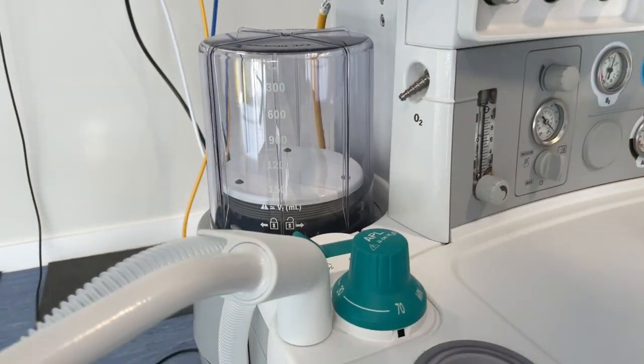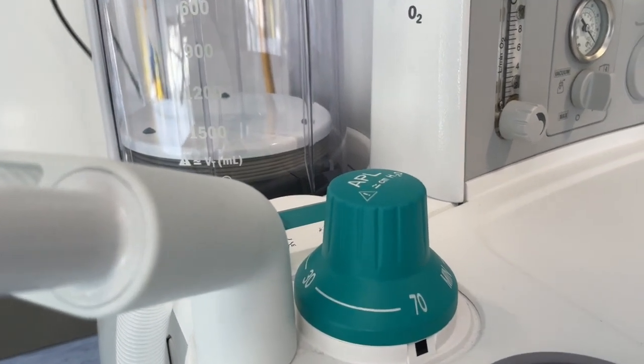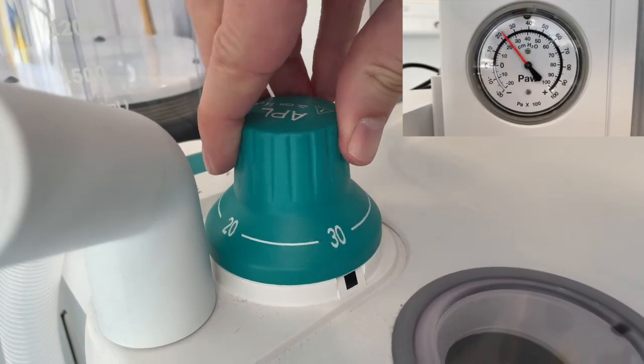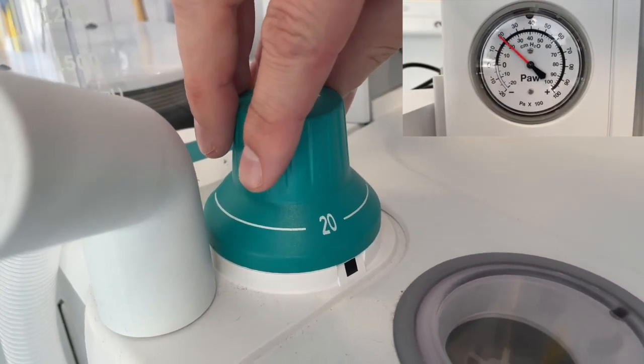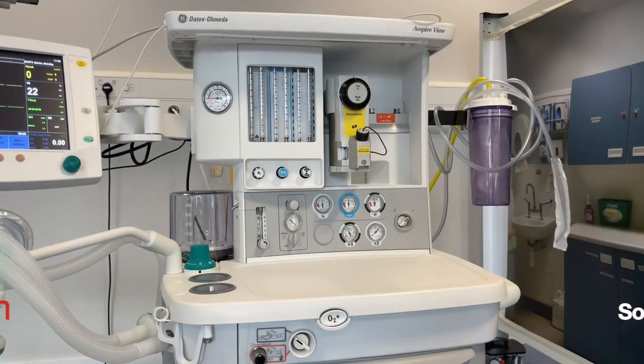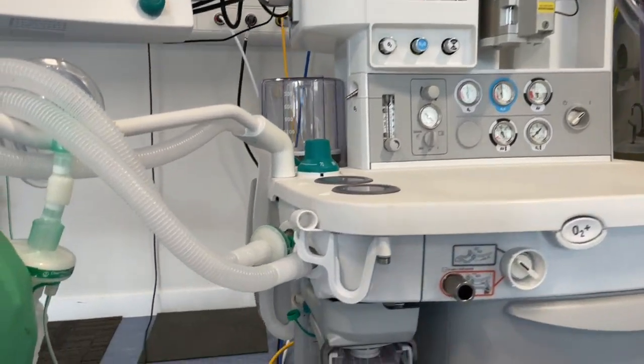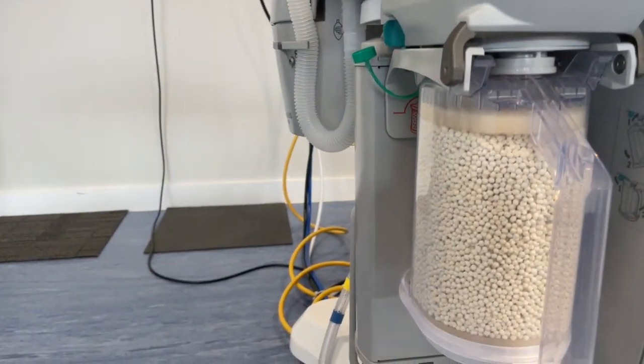With the system still pressurized we can check the APL valve. Open the valve to 20 centimeters of water and see how this change in pressure is reflected in the pressure gauge. Inspect the color of the soda lime ensuring that it's ready for use.